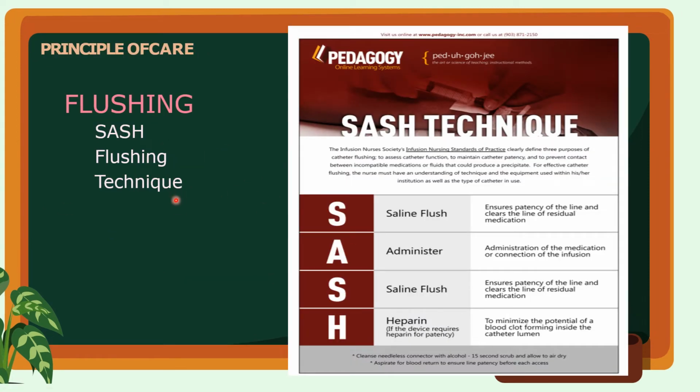The SASH flushing technique can be done by saline flush first to ensure patency of the line, and then clears the line of residual medication. And then you can administer medication or connection of the infusion. After that, you can flush your line again with saline.